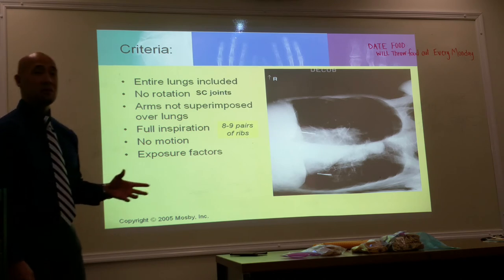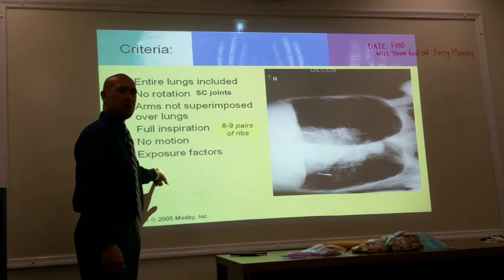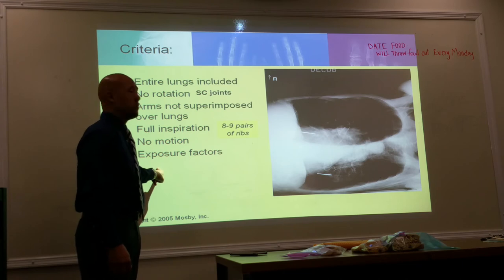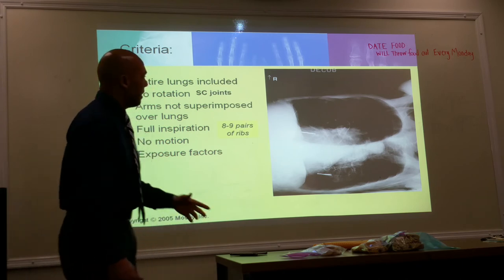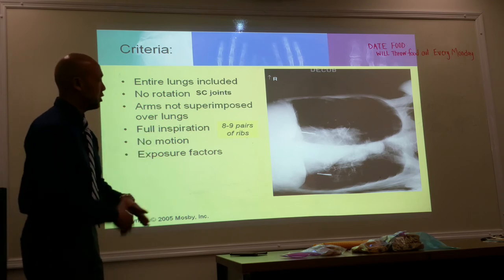I don't know why they use this for this slide. Do you have the same picture in your book? The latest edition? The same one? Oh, no, the newer one? Okay. But again, chest x-rays, long scale, more grays. This is too short scale, too black and white.